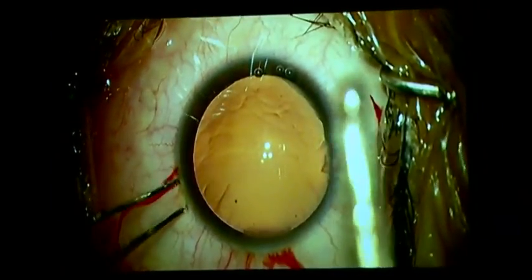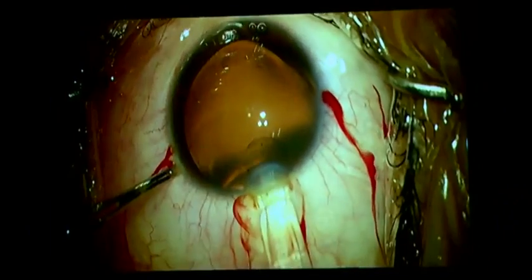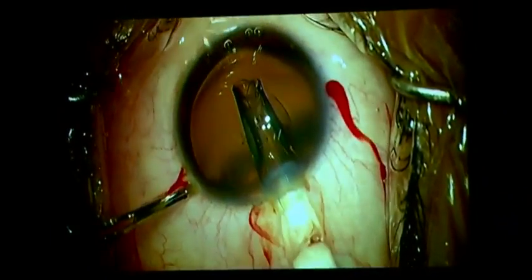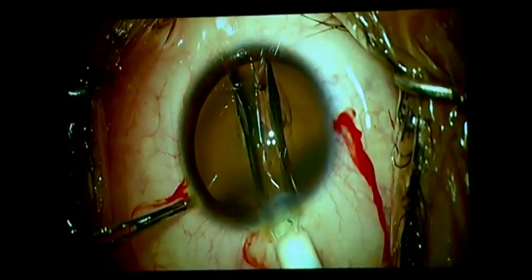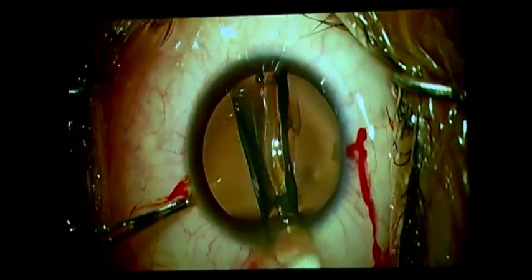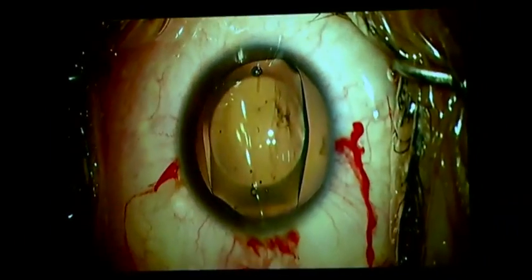So normally I'll fix it with my left hand and inject the lens. But this time I'm not sure because I have Helon inside and Helon in the lens also. Go gently and make sure the lens opens. Now it is opening correctly. Once it opens correctly, you can inject further. If you are a little worried, you can leave it at the wound area. Just tuck it. It will open very correctly now. So it has opened beautifully now.